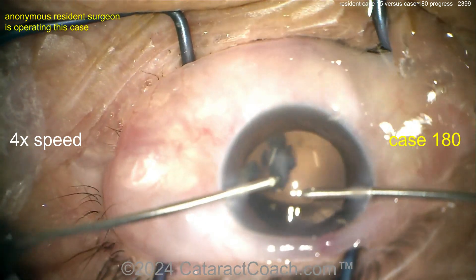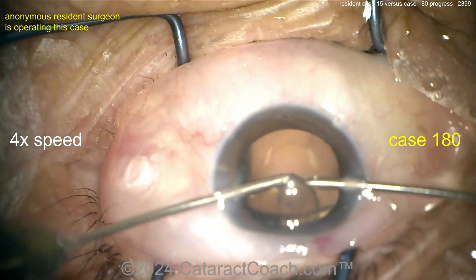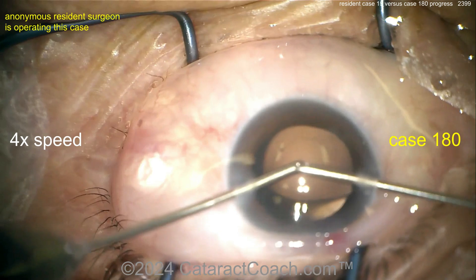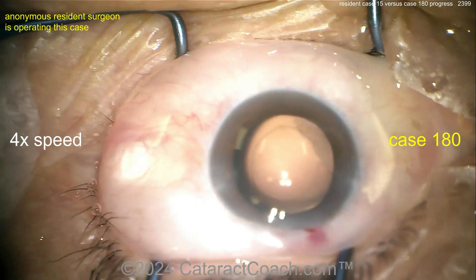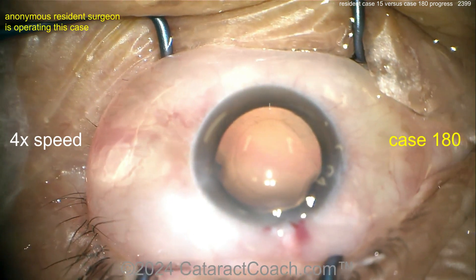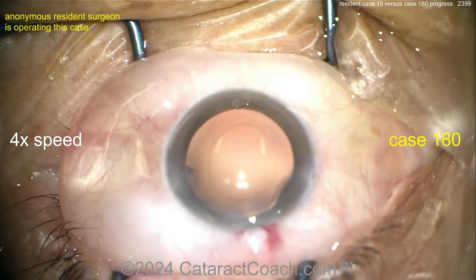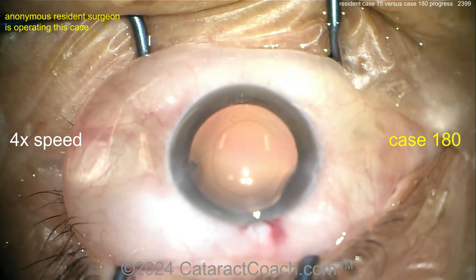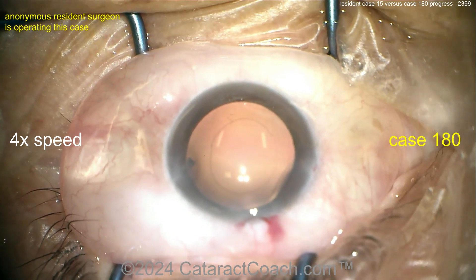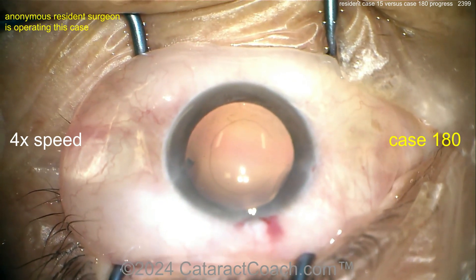You can just mush the nuclear chip down with the I/A probe. Now cleaning out the rest of the cortex. This is a reasonable case — not bad for 180 — but we need to improve more. My number one tip: fix that rhexis. You can't keep doing a baby rhexis that's not well centered. Figure out the balance of the incision — barely nicking the limbal vessels without getting chemosis. Actually, the rhexis isn't bad — let me take that back. It's better than case 15. My main issue is the microscope lights are not in the center of the cornea — patient's chin is down.